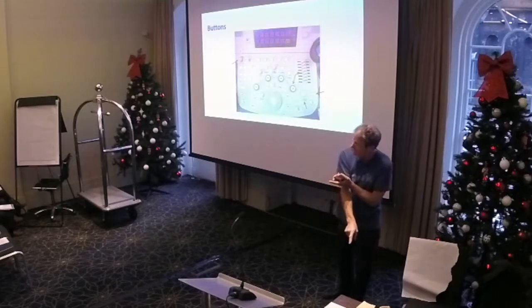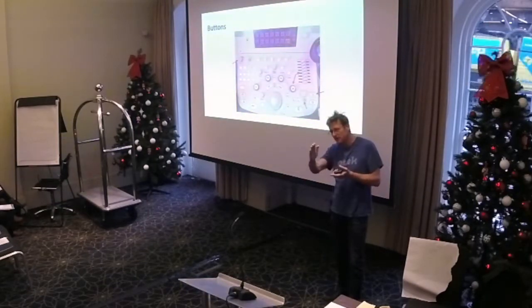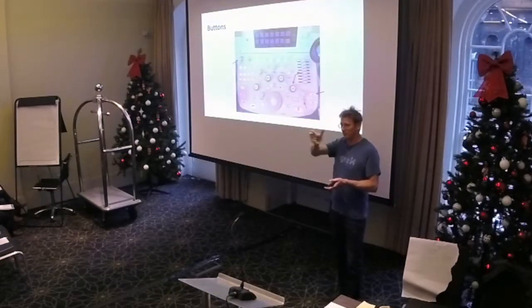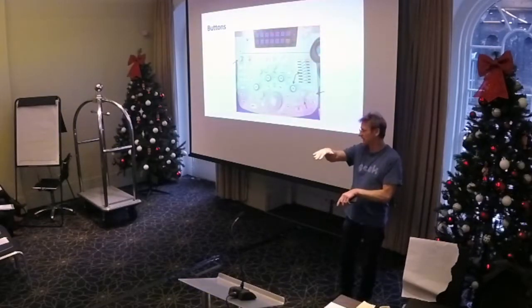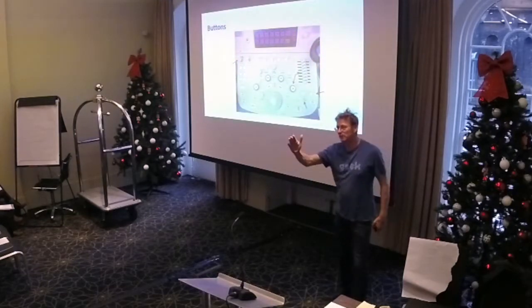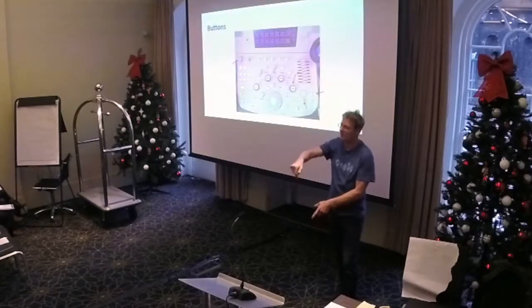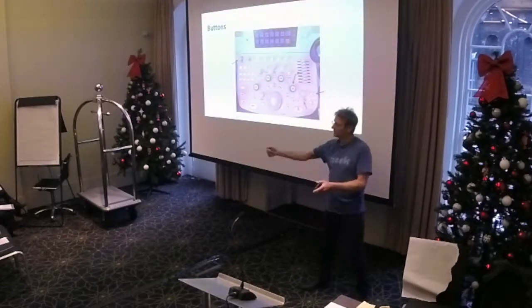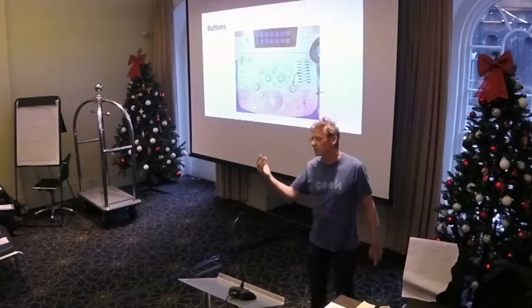And then some of the signal gets passed, it goes a bit further, and it times how long that comes back. And then it does that across the row. It goes, fire that one, fire that one, fire that one, and it's sweeping across. And then it gets a composite image of the reflective areas. So stuff that's more reflective is going to give you a bigger signal. Now, if you've got a structure that's vertical and the beams are coming down, there's nothing for it to bounce off. It's not going to show up. So move your probe around here, and then it's got something for it to bounce off. So simple stuff like that, a lot of people don't understand.